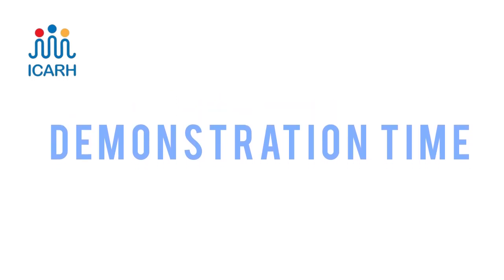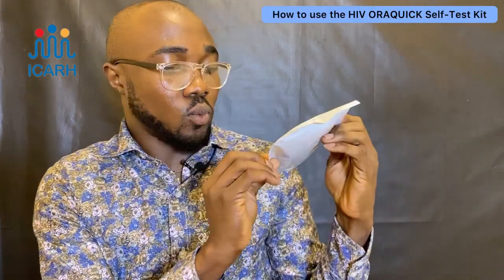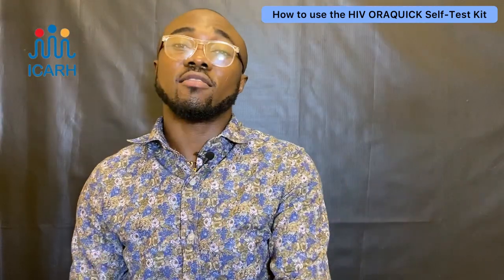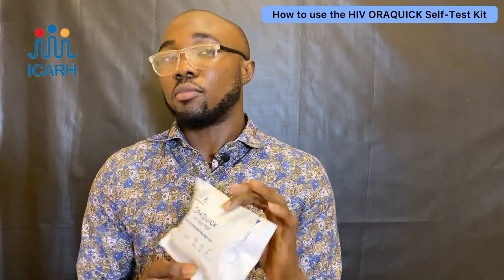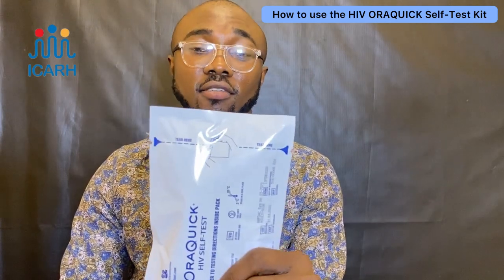Now let's jump into the demonstration itself. First, always check for the expiry date on the test kit — it should be somewhere around here. Please make sure you check this expiry date wherever you buy or receive it. This one expires on the 31st of July 2020, which means it's very valid.